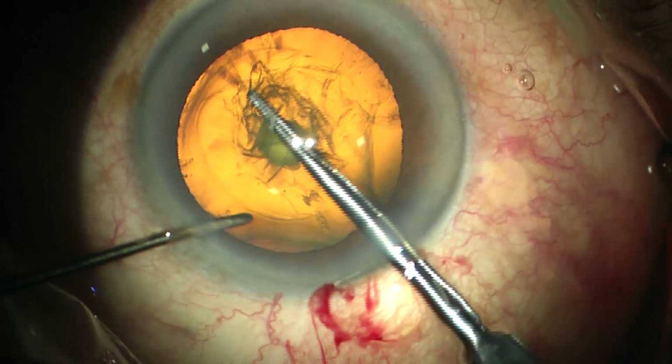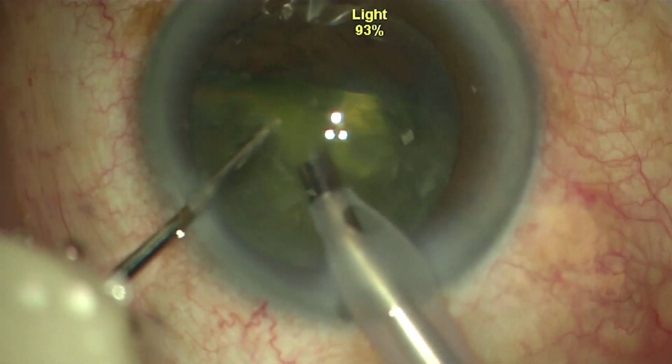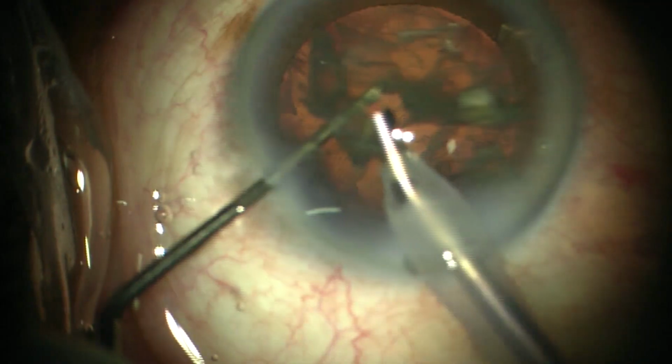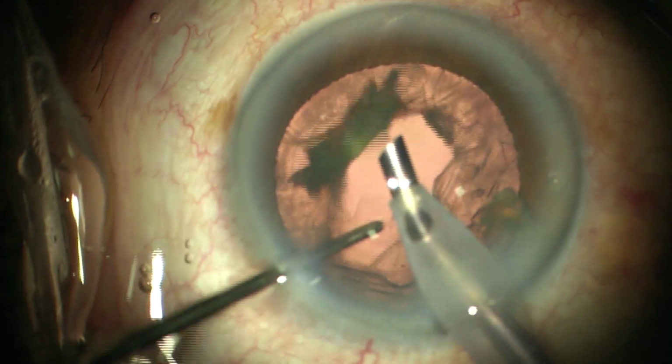A case of posterior polar cataract wherein the same principle is followed. There is a dehiscence in the posterior capsule and I can see the two typical pillars in the posterior capsule, which is very typical of posterior polar cataract with pre-existing dehiscence.